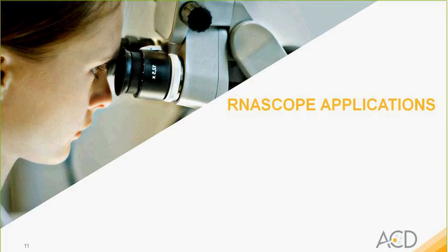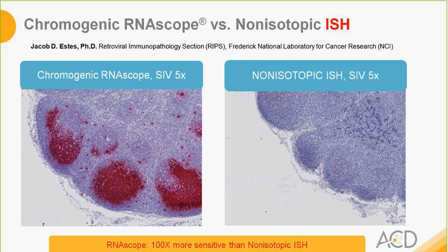Before diving into the details of the scoring, that it's really the heart of this webinar, I thought it would be instructive to review a few of the many applications RNAscope fulfills and that have been described in some of these publications.